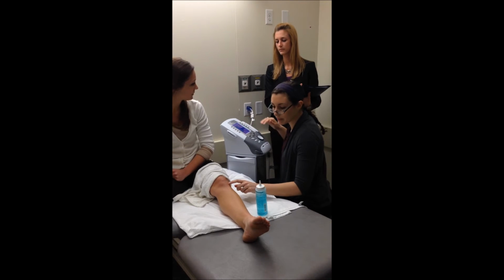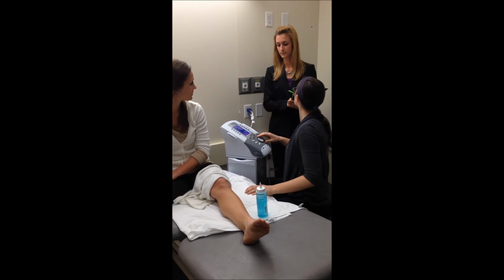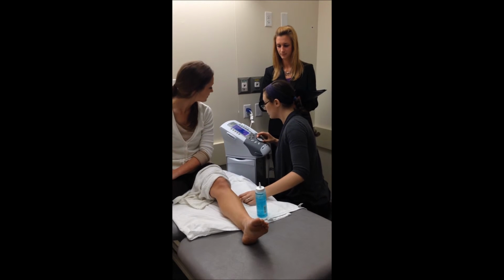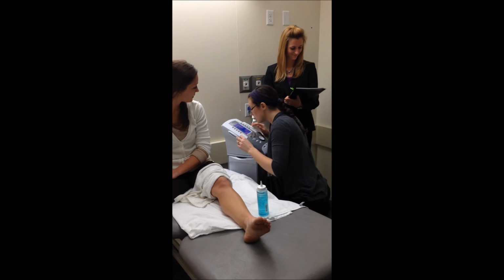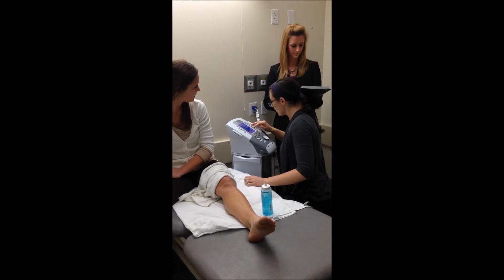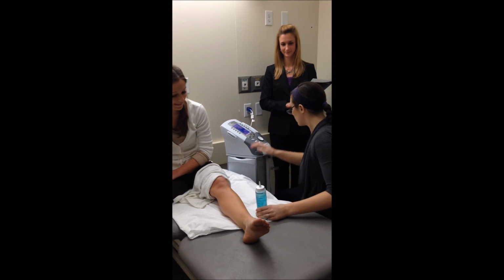And I'm going to do 3 because I think it's pretty superficial. Very good. What else do you want from me? How about the intensity? What are you going to choose? How tough are you? Okay, we'll do low. We'll do it real low. How about like 1 W/cm2. Okay. And then it's already on 100. I think that's probably right. And I know we got to do 8 minutes, so I'm going to do 8. That's what I've been taught, so that's what I'm going to do.